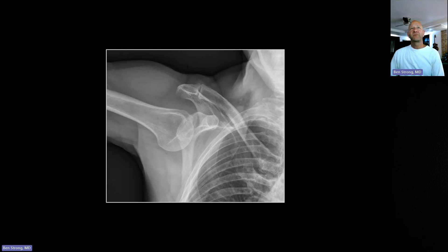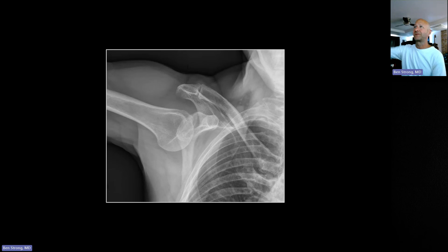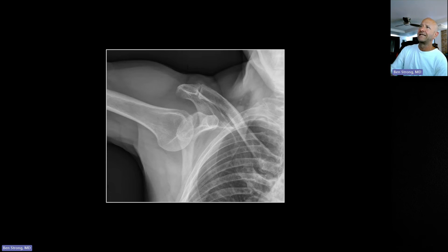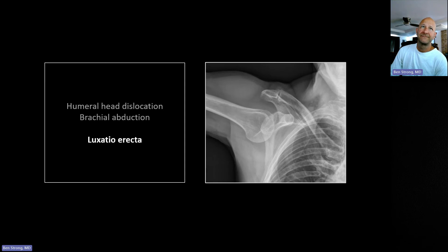Now moving off the spine into the shoulder: this is a dislocation of a particular type — you can see the patient is stuck in this position. These are not hard to diagnose clinically; the patient comes in with their arm like this and can't put it down, so imaging options are limited. The typical mechanism is someone falling from a height, reaching out and grabbing something at the last second — for example, falling from a roof and grabbing the gutter. This is known as luxatio erecta, and you can see the humeral head is not at all aligned with the glenoid fossa.